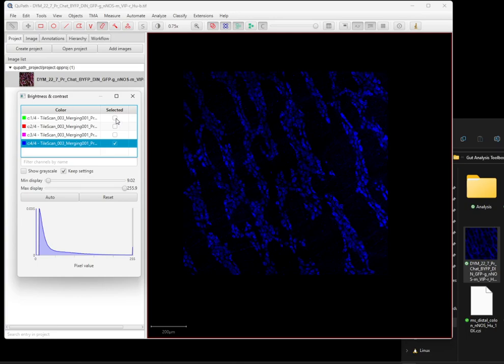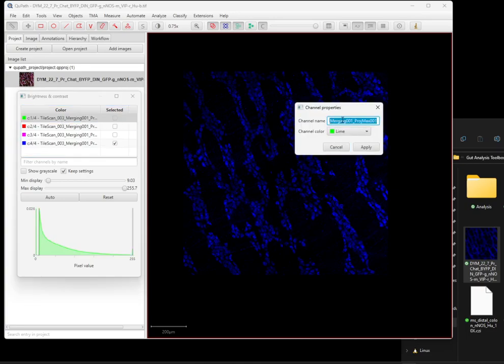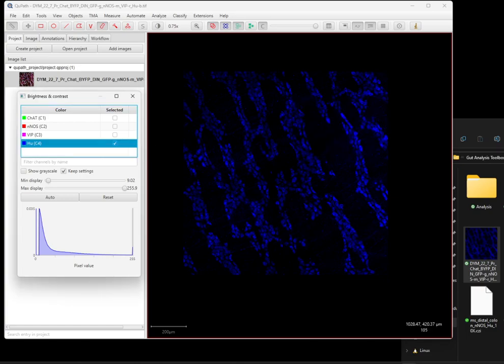So a general recommendation is that you can see that the channel names here don't say what the name of the channel is, so I'll rename the channels. It just makes analysis easier. So apply, I think this was VIP. All right. So now we've got these 4 channels. It's just easy to identify them now.